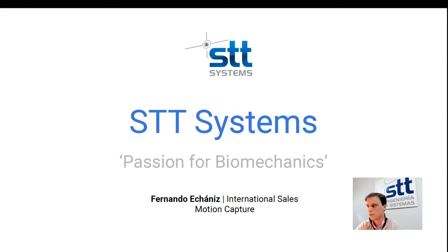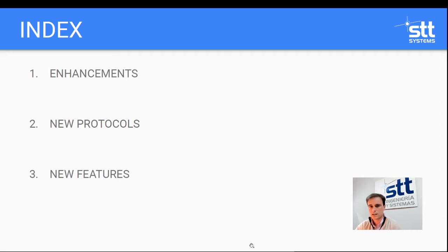as simple as possible, I'm going to present you the index that we are going to follow. First thing, I want to show you the enhancements that we have developed in the already done features that the system already had. I also want to show you and explain what new protocols we have added to the system and what you will be able to do with them. And finally, which are the new features that we have added and just released in this version.